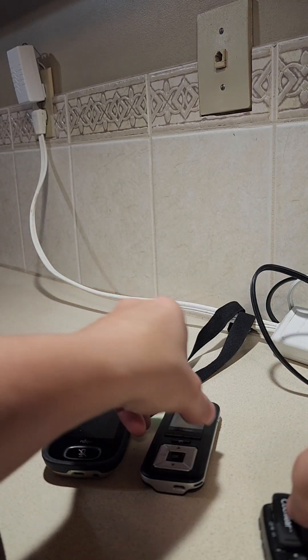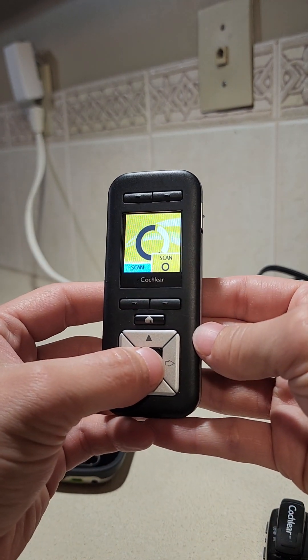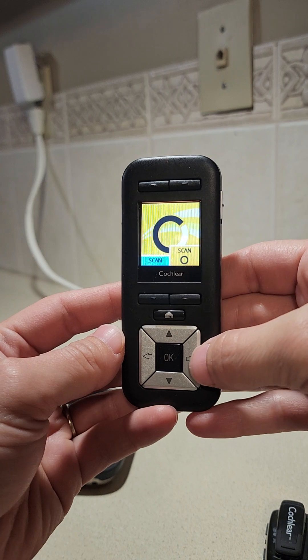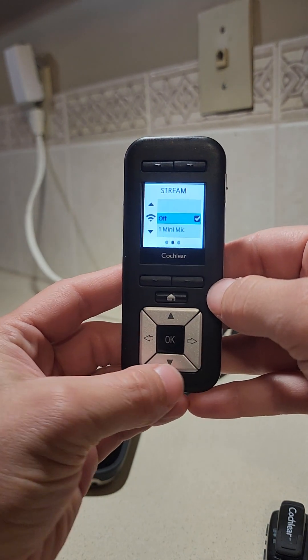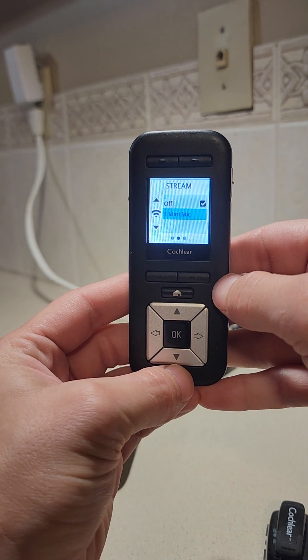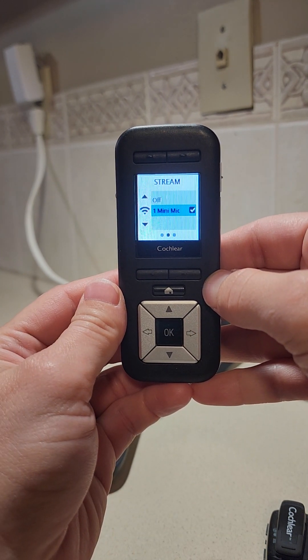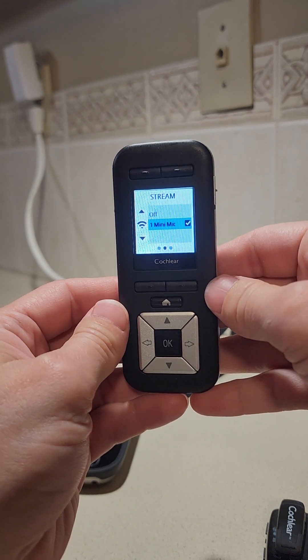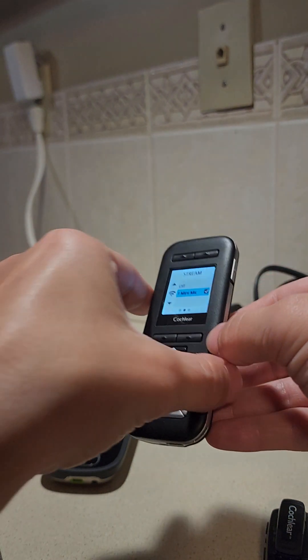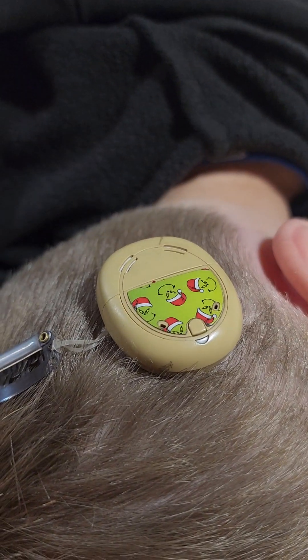Once that option is chosen, we'll go back to the remote assistant. To turn on Bluetooth, press the sideways button, then press the down button, and then hit OK. That should connect the Mini Mic and the Bluetooth component of the processors, and at that point the processors will not have any lights at all.